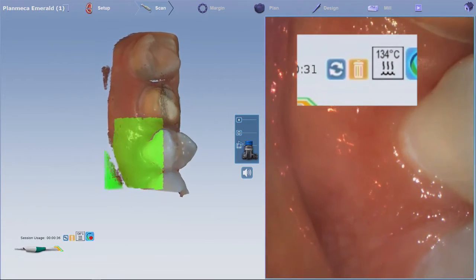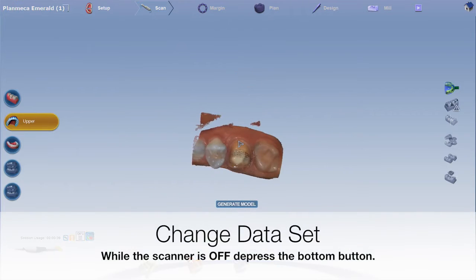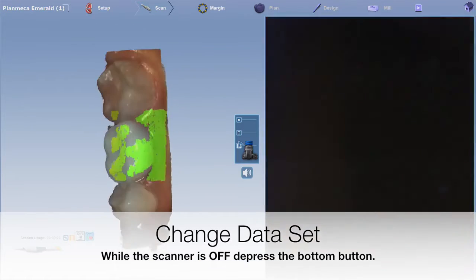In the lower left, after you've turned off the scanner, you can generate the model and move to the next scan option by depressing the bottom button.